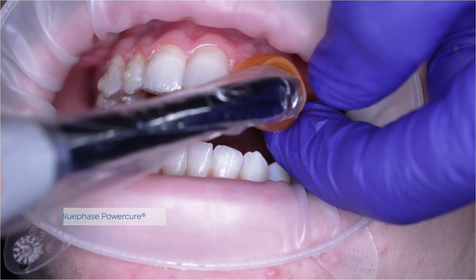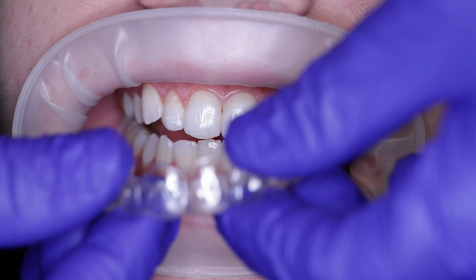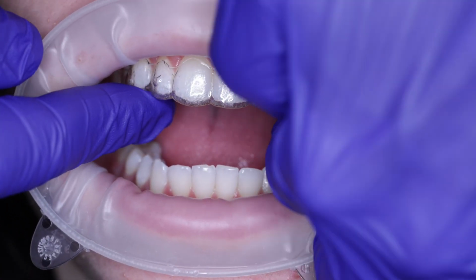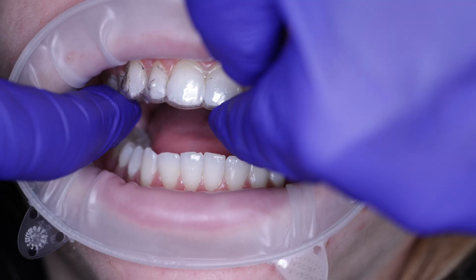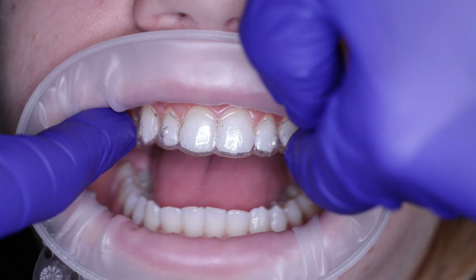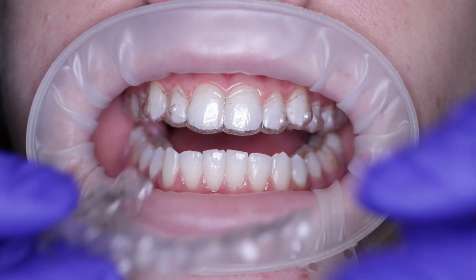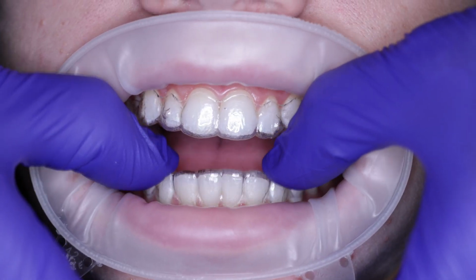So let's jump right into it and let's do a recap, okay? Because I'm a soft talker sometimes, but I'm also a very fast talker. So the first thing we want to do is try in the template, make sure it goes all the way down, make sure it fits, and most importantly, making sure that we try in the first aligner. That is imperative, okay? Making sure everything looks good. We don't see a whole lot of space. We call it a window. And making sure, again, it goes into place. And we're going to try in both templates, upper and lower.